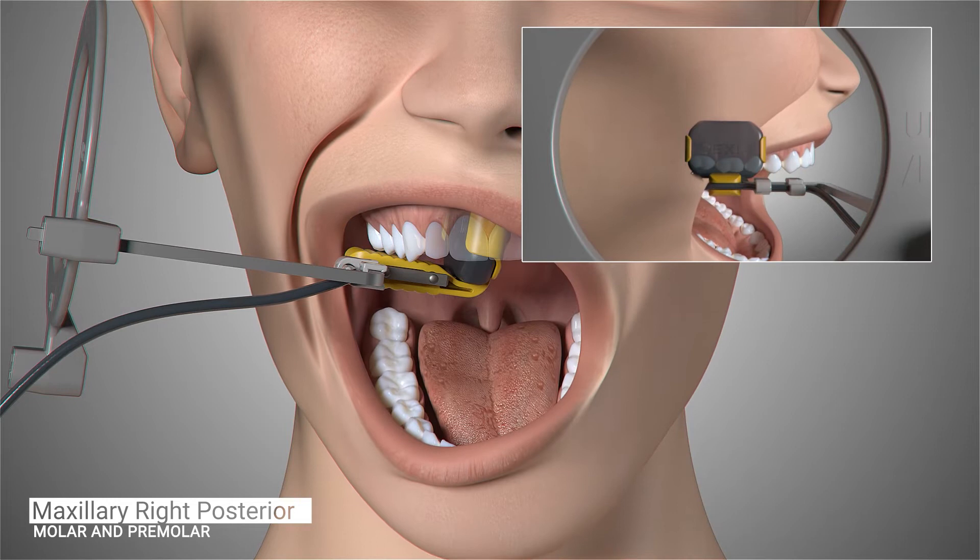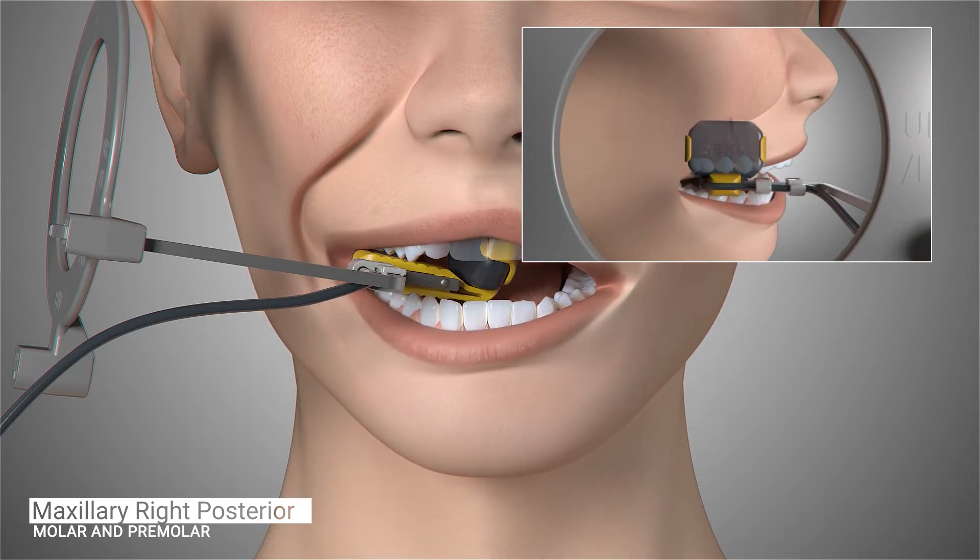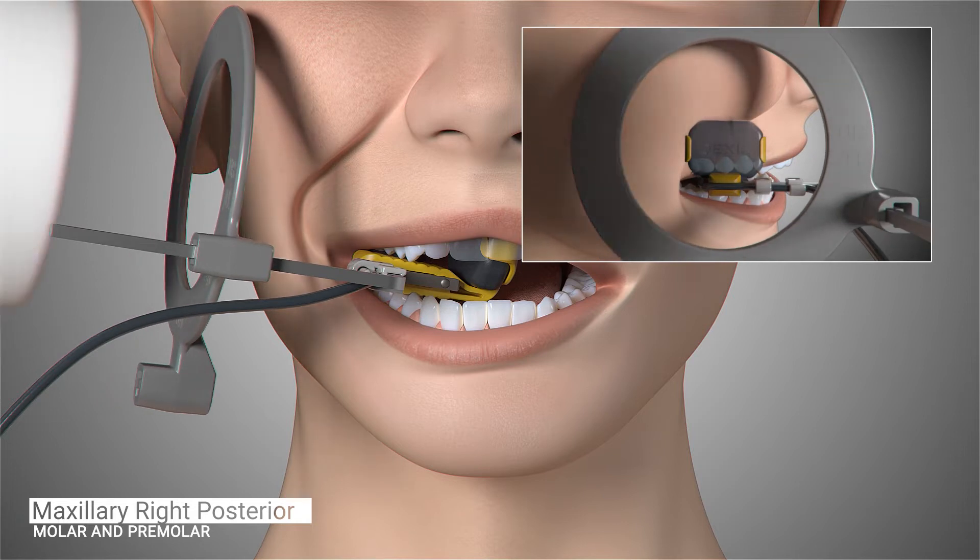Ask the patient to open slightly and gently slide the sensor forward so the contacts of the first and second premolars are centered on your sensor. The sensor should be placed far enough forward to capture the distal of the canine. Ask the patient to gently close, position the cone of the x-ray emitter, and trigger the exposure.